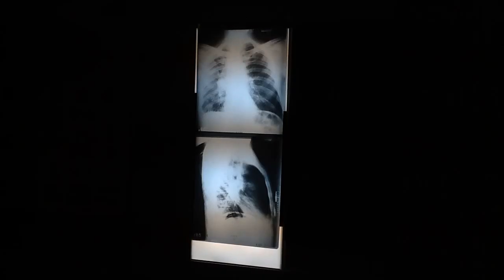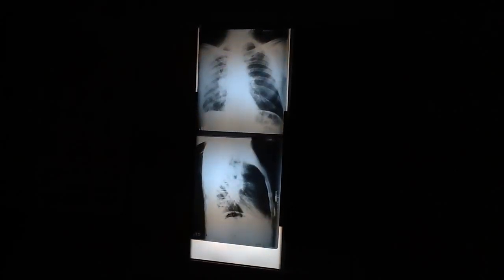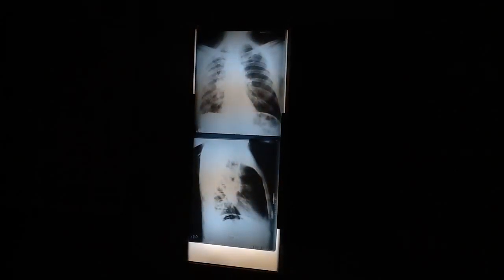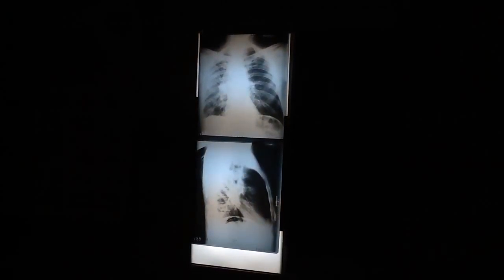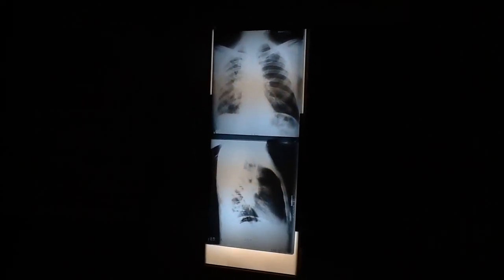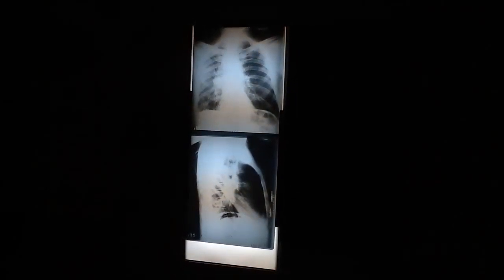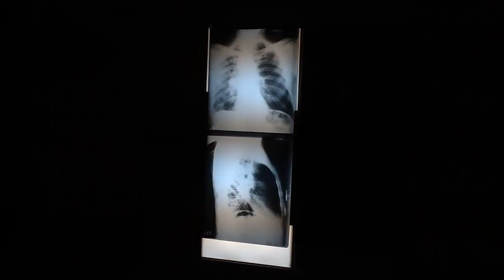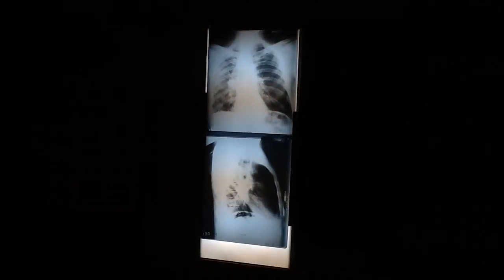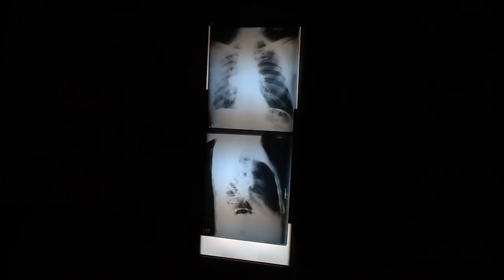What was number 5? Cavitation. We know tumors can cavitate. We know they tend to have thick walls, irregular inner borders usually. They may incompletely cavitate. They can mimic mycetoma. We talked about that. We also talked about the 6, which was the pneumonitis, where a tumor can either look like consolidation or the tumor causes obstructive pneumonitis by blocking the normal drainage out of a bronchus.